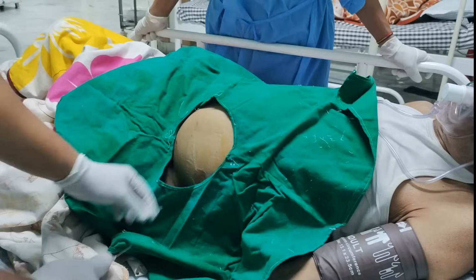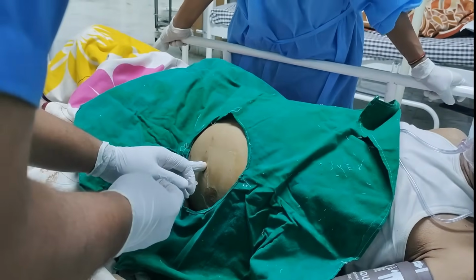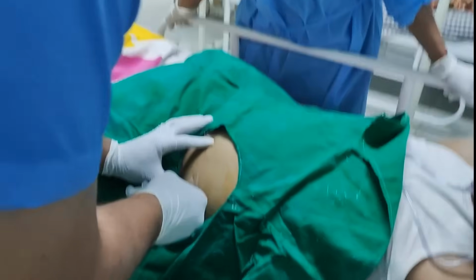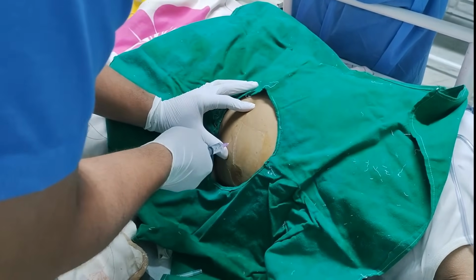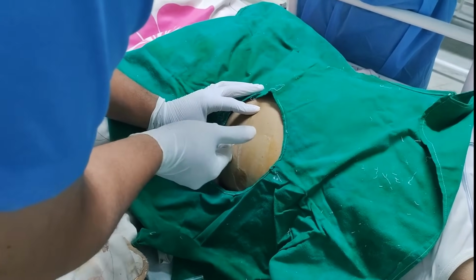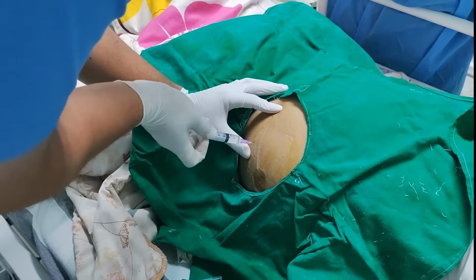Using a 25-gauge needle, place a wheel of local anesthetic over the insertion point. Switch to a larger, 20 or 22 gauge, needle and inject anesthetic progressively deeper until reaching the peritoneum, which should also be infiltrated because it is sensitive. When the needle is advanced, maintain constant negative pressure to ensure lidocaine is not injected into a blood vessel.